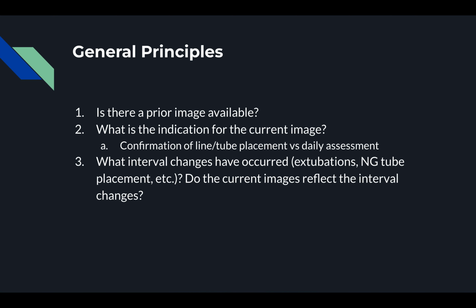So starting off with some general principles, the first thing that we think about when approaching any imaging is what prior images are available. Did the patient have an x-ray the day before that we can compare this current image to? Perhaps they had a CT scan that might be insightful as to what we're looking at today. So, taking a quick stock of what images have already been obtained recently.